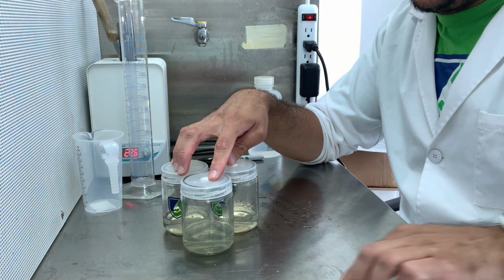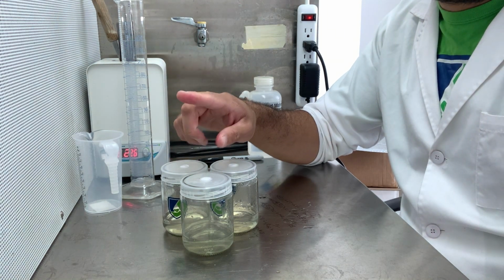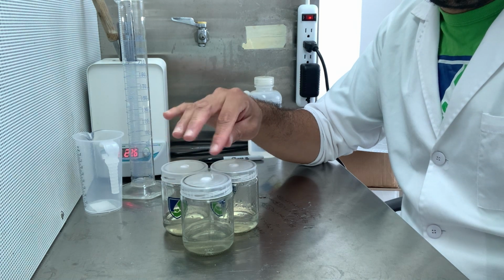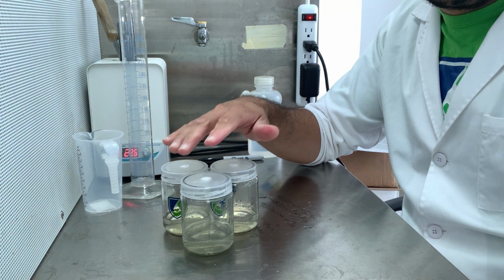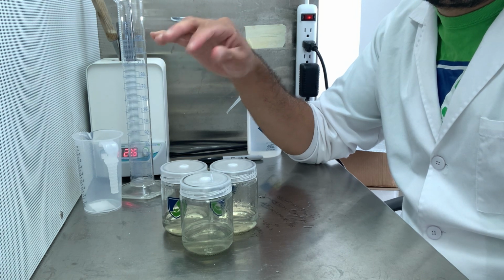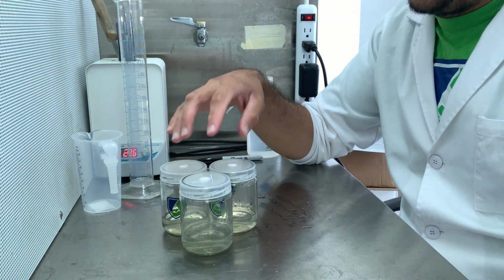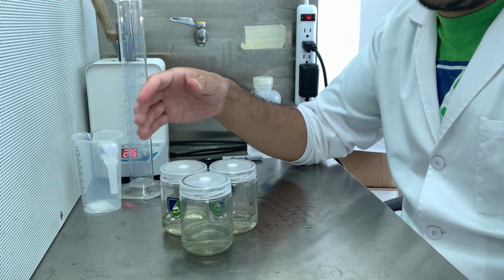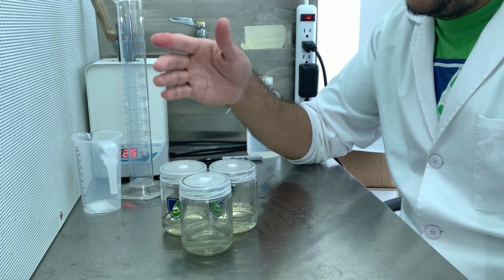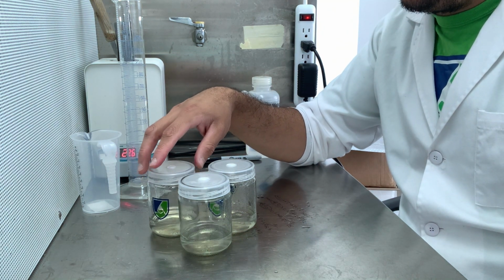I already made a video on which is the best pressure cooker for tissue culture. Go give it a watch. The one thing I can tell you is that electric pressure cookers don't work on 15 psi, which is what you need. They only work between 10 and maybe 11, 12 psi. They may go to 15. That's when they start releasing pressure. However, they don't keep a constant 15 psi. So I will suggest to stay away from electric pressure cookers, unless there is one that can only keep 15 psi. So make sure to check the video out and use this in the pressure cooker.